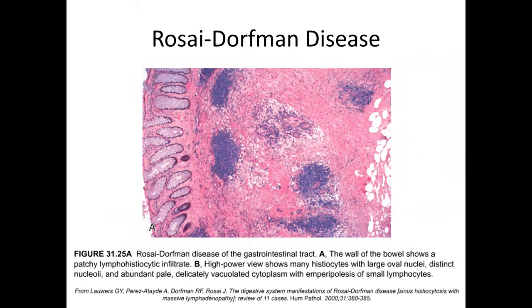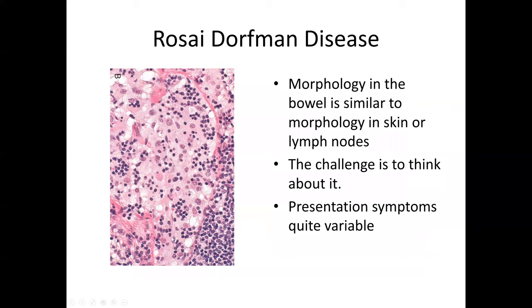Rosai-Dorfman disease has been described in the colon, though it is not frequently encountered. The morphology tends to be similar to what you see elsewhere, but the challenge is to recognize it. What you'd expect to see are clusters of lymphocytes and areas of more pale cells representing the histiocytic component, along with emperipolesis — lymphocytes involving the cytoplasmic spaces of the larger histiocyte cells. The presentation is not particularly specific, so recognizing that it can occur here is key.